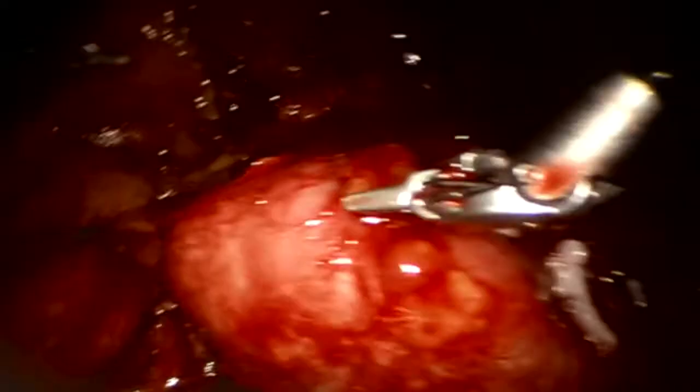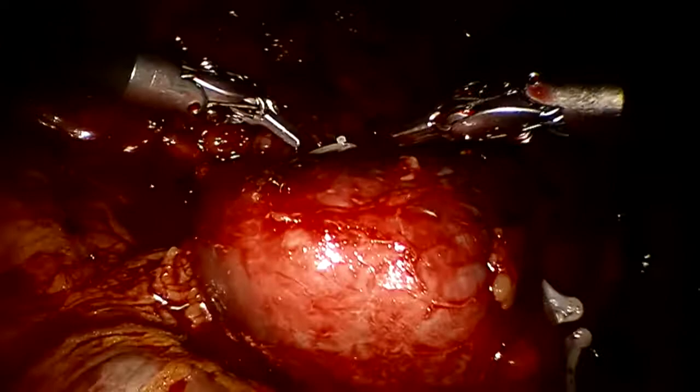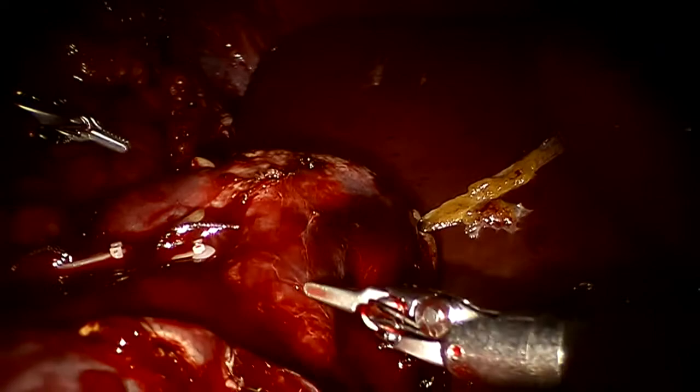Here we go. Good. Okay, this looks very good, so let's not mess with this guy. As far as the vascularity is concerned, you can see the lower pole, all good. This area is blue, lower pole is fine. This area is blue posteriorly only, but the rest of it looks very good. Upper part, really no issues. Maybe a teeny bit, but not really. All this looks A-okay to me. Anteriorly, looks totally good.